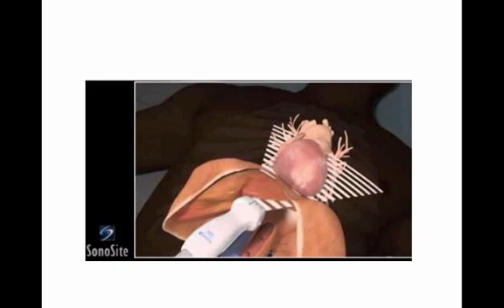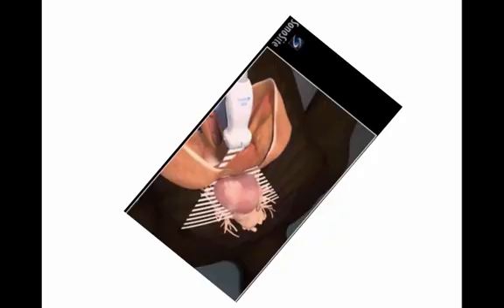In this diagram, you can see the probe here. It emits a beam, which is here. You can see that the plane of the beam intersects the liver first, then the heart. How is this displayed on your ultrasound screen? Well, if you rotate this image so that the ultrasound beam is at the top, you will begin to understand the orientation that you see on your screen.